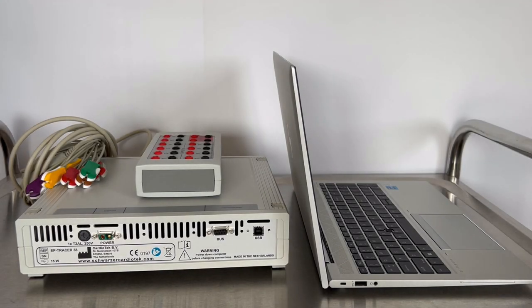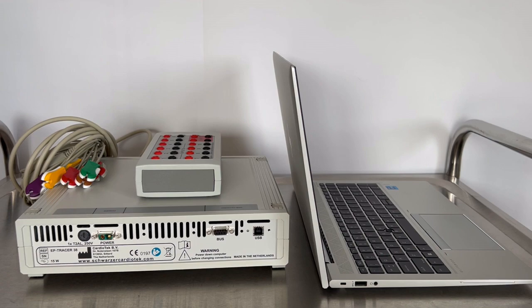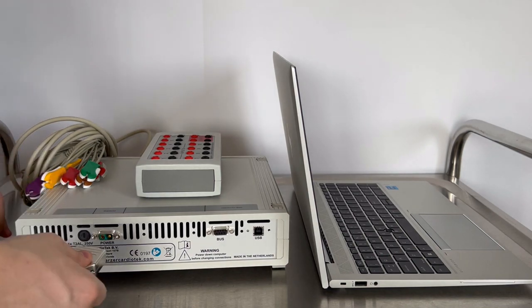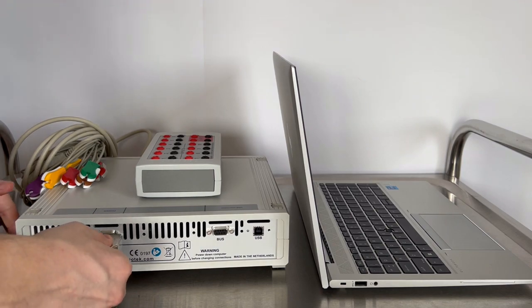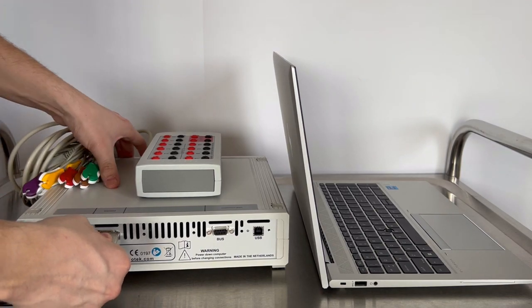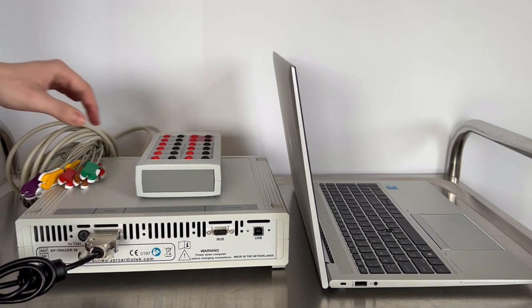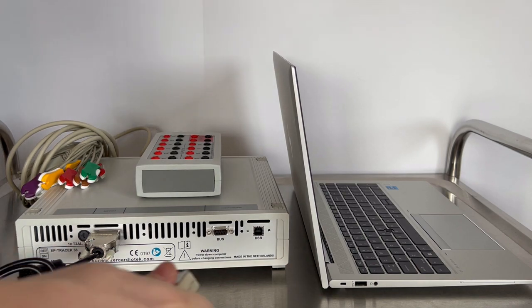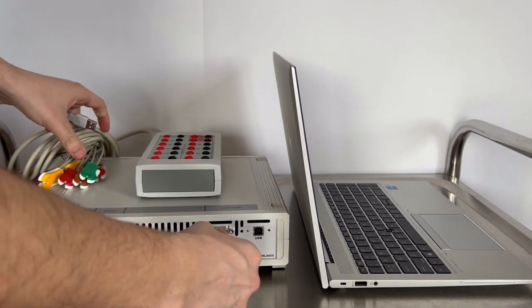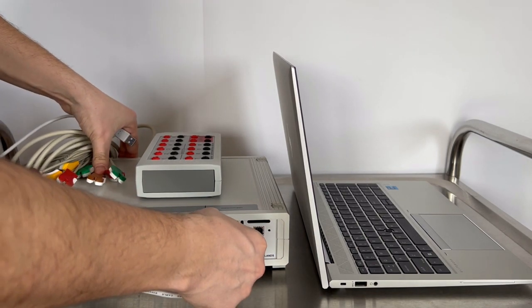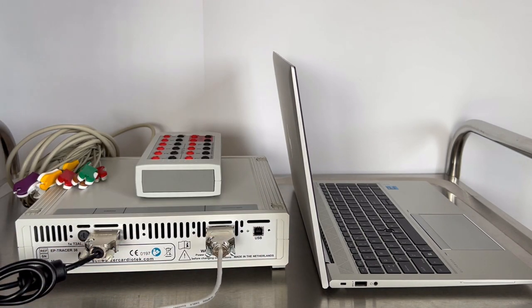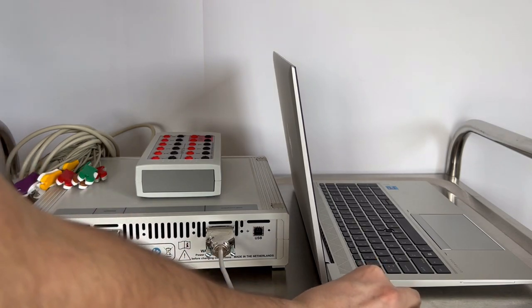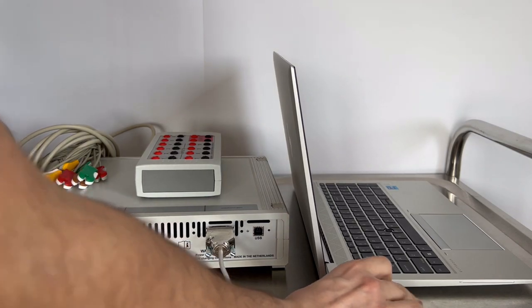Turning our attention to the rear of the amplifier, we observe two primary connections. One is designated for the power supply. The other one is to facilitate the link between the amplifier and the laptop. Both connections are labeled on the upper part of the amplifier.